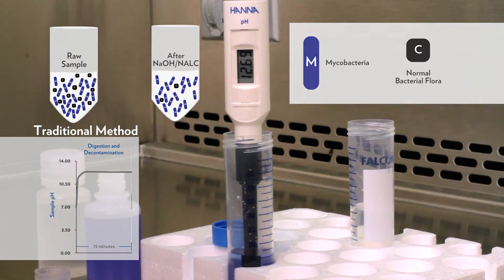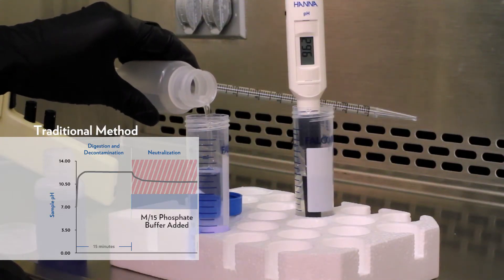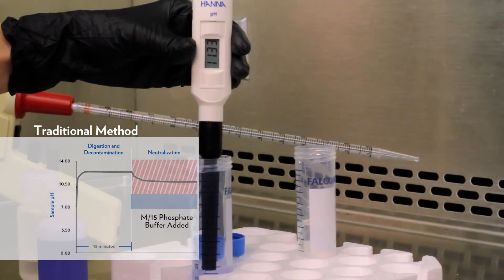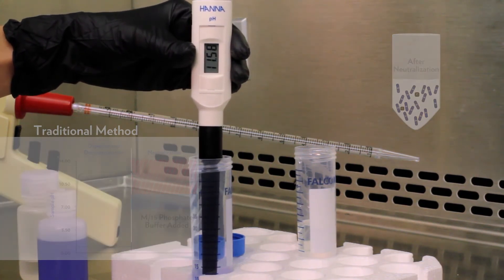The second step is to add m15 phosphate buffer in an attempt to neutralize the sample. If a sample is not properly neutralized, it remains at an elevated pH — in the red zone — which is an environment harmful to mycobacteria. As you can see, m15 phosphate buffer does not properly neutralize the sample.